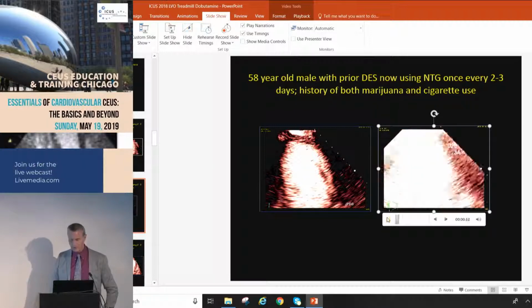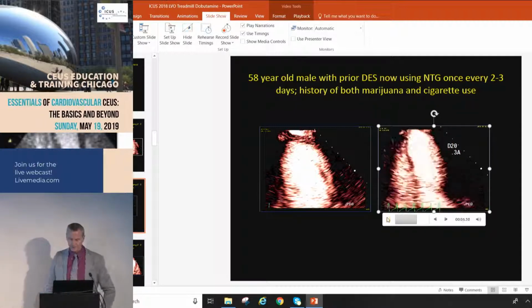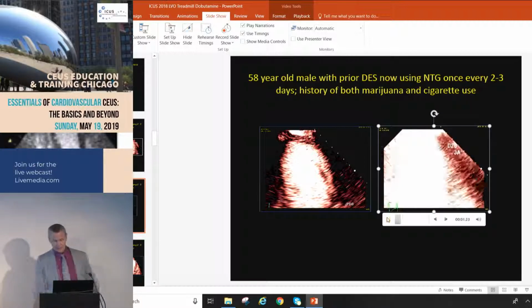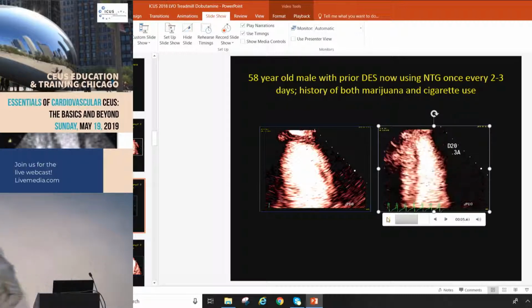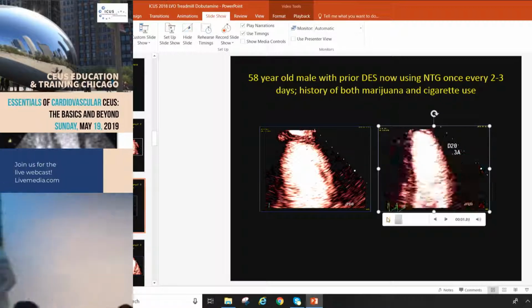Yes, anteroapical, and we thought it even involved a little bit of the distal inferior. And we didn't really think the basal inferior was doing that good either. After that high MI impulse, as we inspected that and compared it to the rest, we thought this maybe wasn't doing a whole real good either.